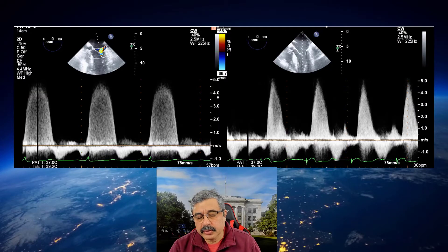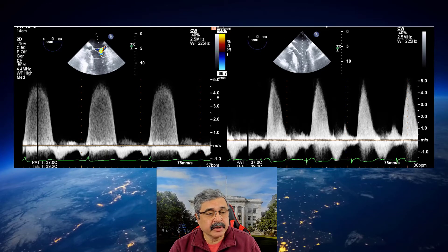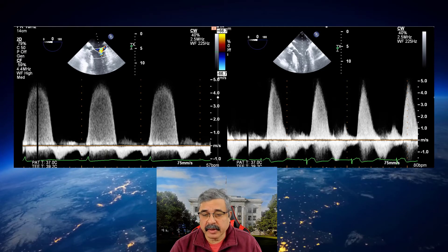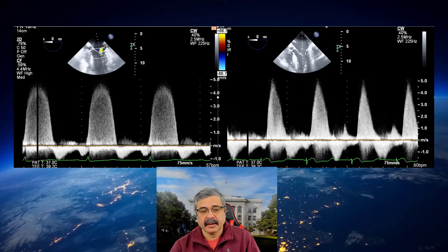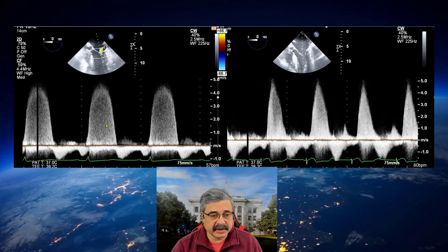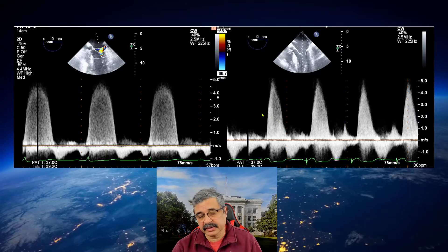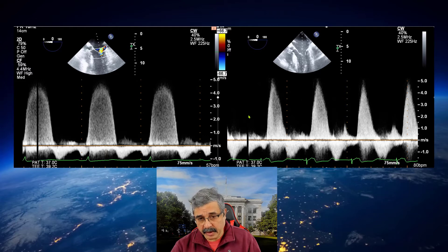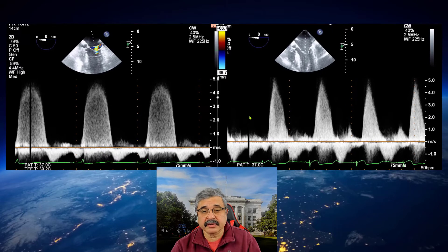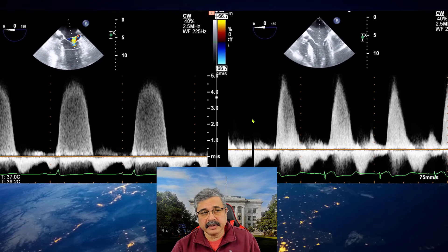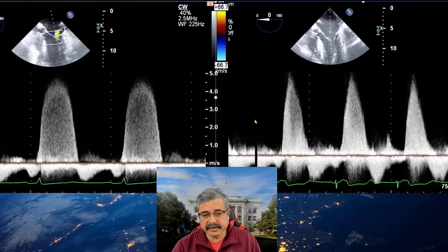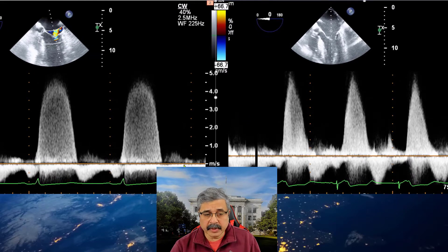Looking at these two graphics carefully, there are numerous subtle signs that can tell you that MR severity is increased. As you can see, the signal on the left is not as intense as the signal on the right, which alone tells you that more MR is happening and a greater number of red blood cells are crossing the mitral valve from the left ventricle to the left atrium.